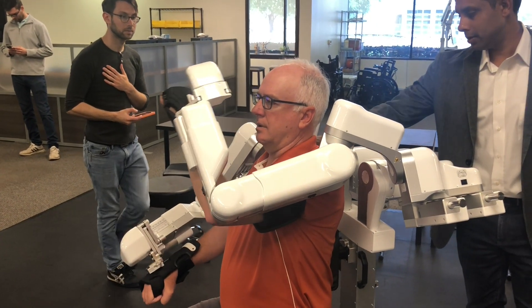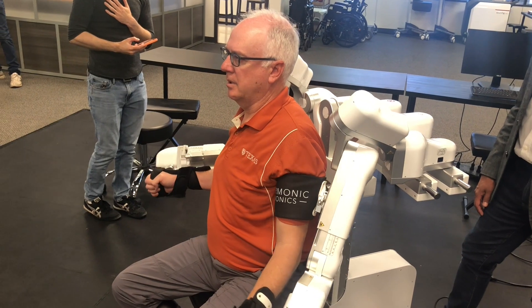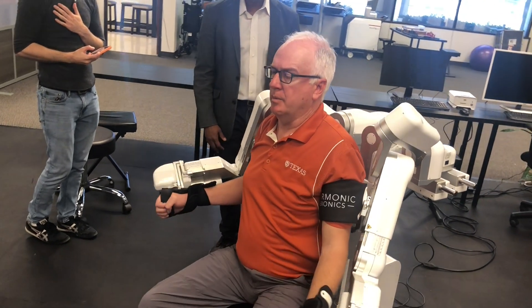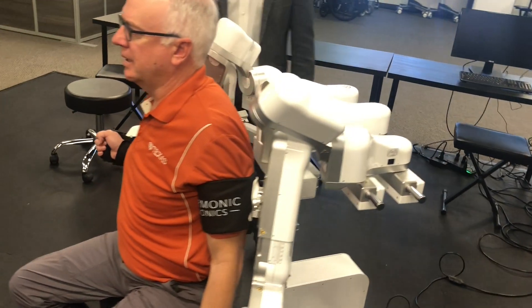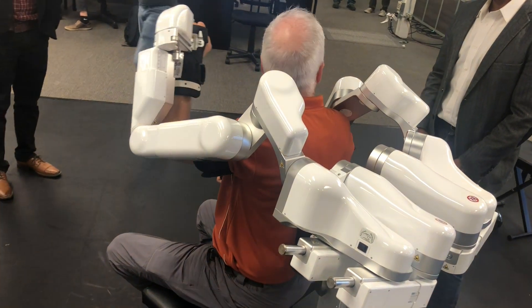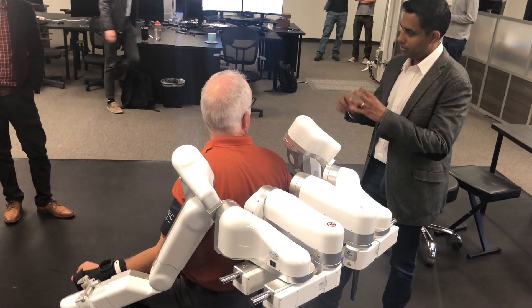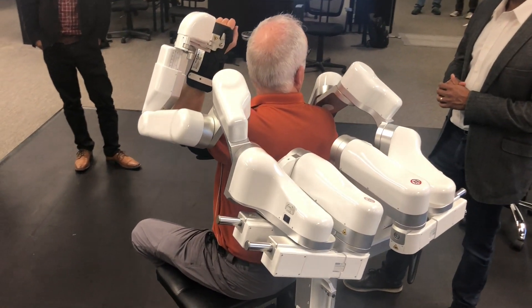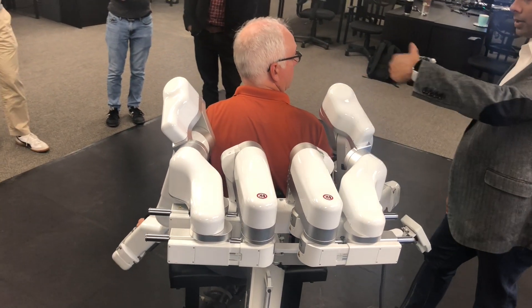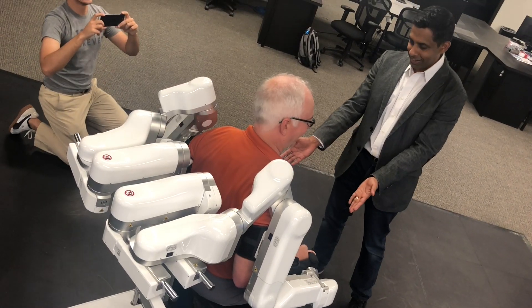After this, you're still staying in... So many stroke patients get frozen shoulder because they're just lying in bed not doing anything for six weeks. In my case it was pretty good — they got me moving pretty quickly. Did you ever have subluxation? Not very badly, a little bit. Because that's a huge problem — whenever we said shoulder, they were saying you wouldn't be able to help because it's going to be subluxed. It was two or three inches lower on the right. All of this is allowing you to still be in — even when you lift — the magic of all these motors.